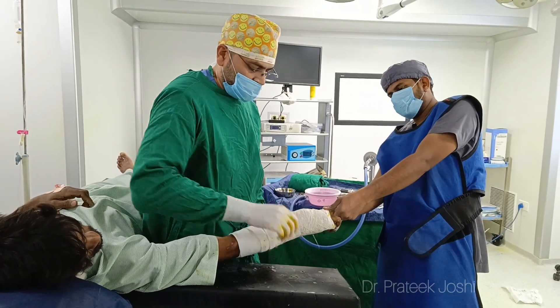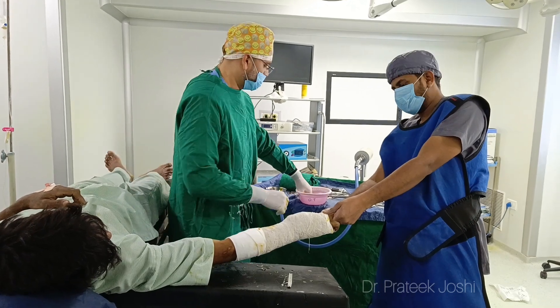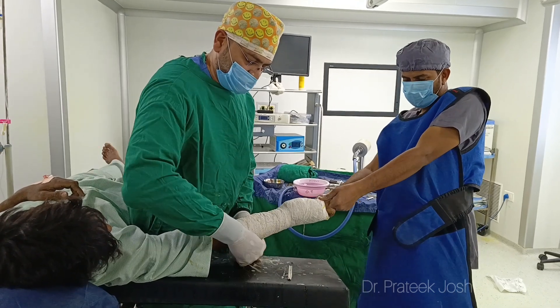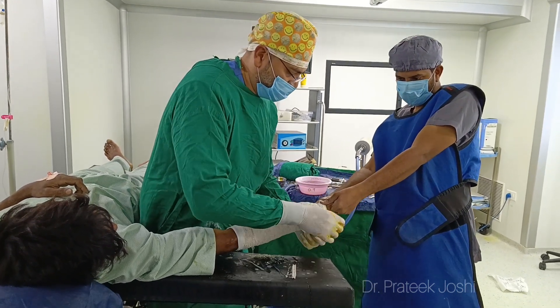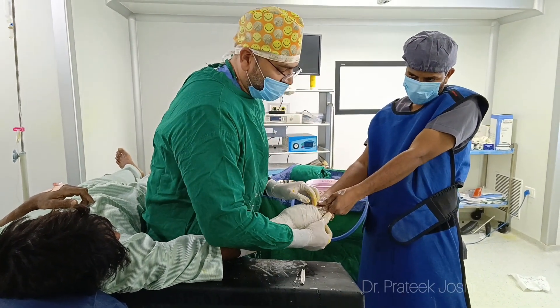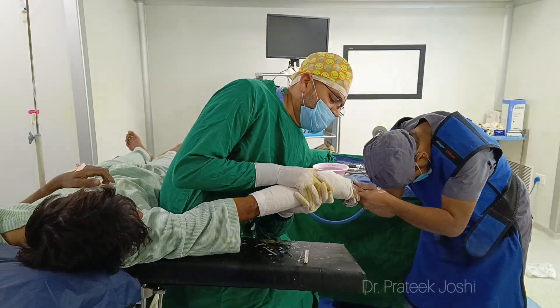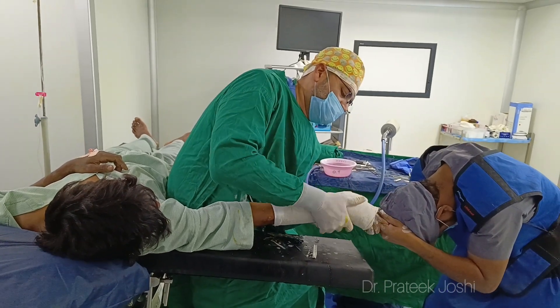On top of the betadine gauze I have applied a sterile soft roll, and on top of that I am applying 4-inch plaster of Paris. It is important to keep the plaster well molded — the plaster should not be too tight and should not be too loose either. My assistant is giving linear traction and we are also going to give palmar flexion as well as ulnar deviation to keep the fracture in a reduced position.